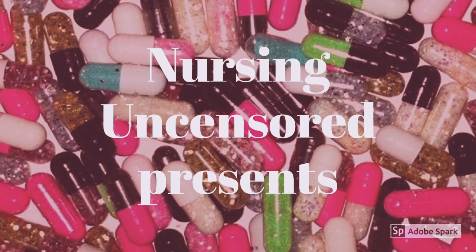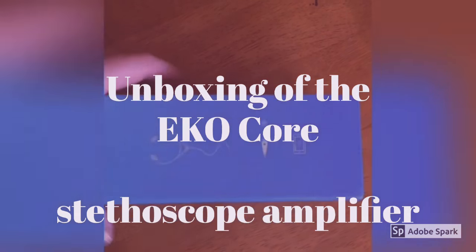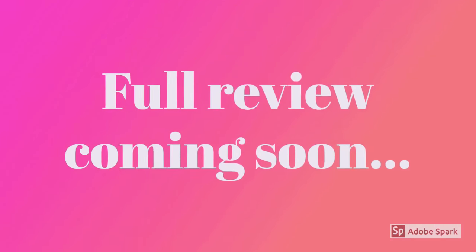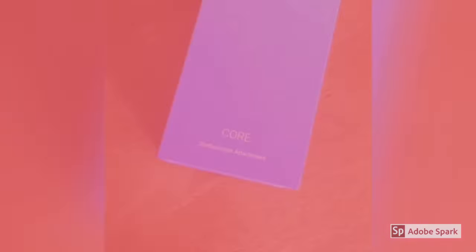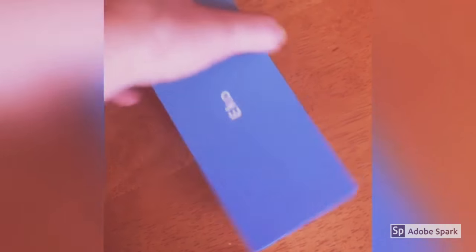Nursing Uncensored presents the unboxing of the Echocore Stethoscope Amplifier. I literally just got this in the mail so we're going to take a look at this box first before we crack it open and see what we have inside. I'm kind of excited guys.